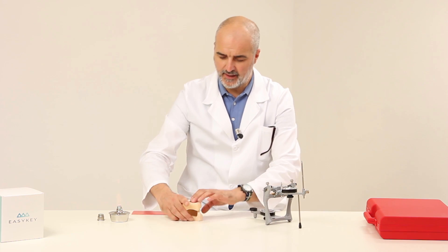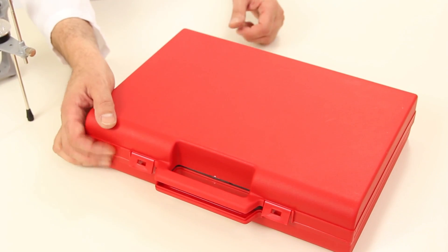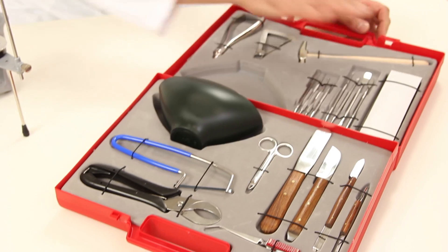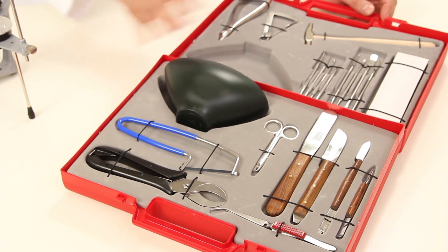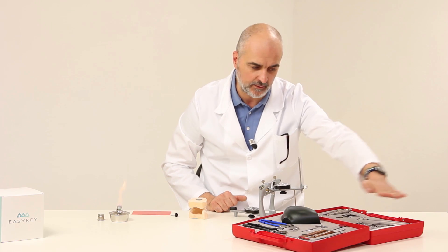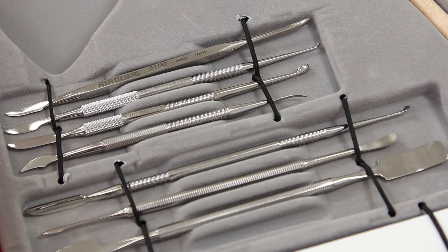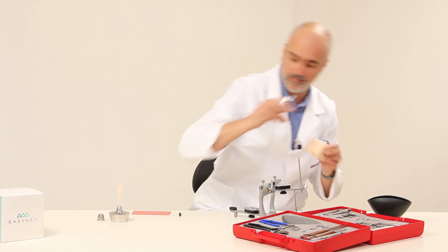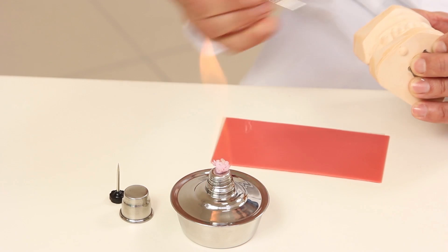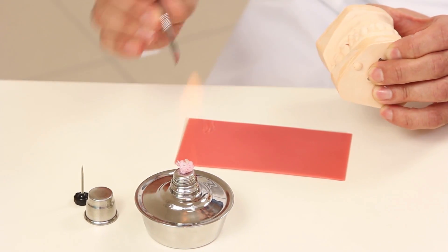We are now ready to use the articulator. We need to position the models so that they can be plastered. To carry out all the procedures from now on, we will use all the necessary tools contained in this small case, from the plaster knife to the little spatulas used to model. Now we take the Lecron wax spatula and heat it. We heat the tool, collect the wax, and fix the models in place.